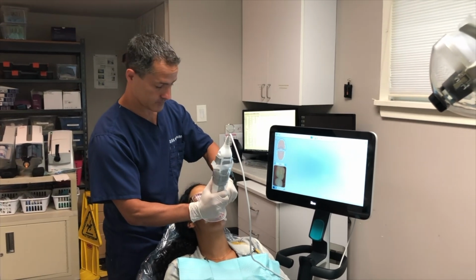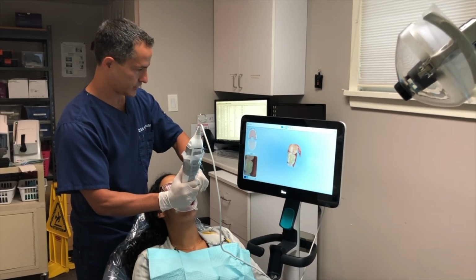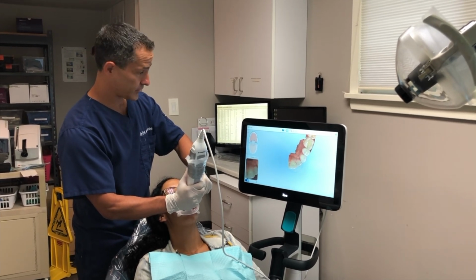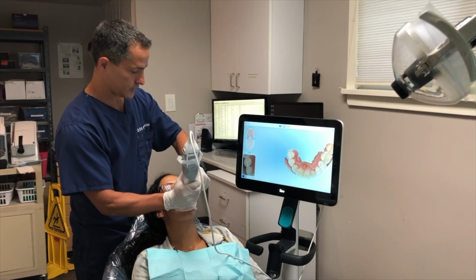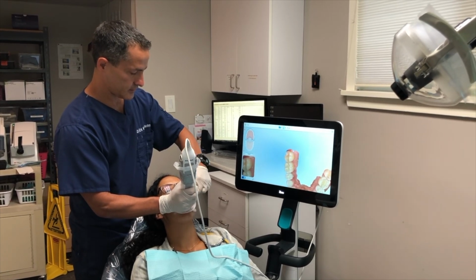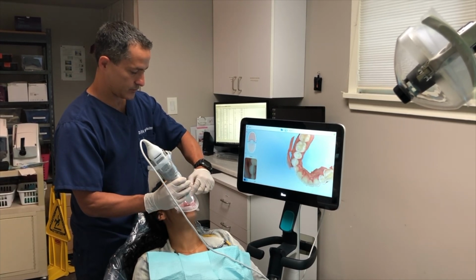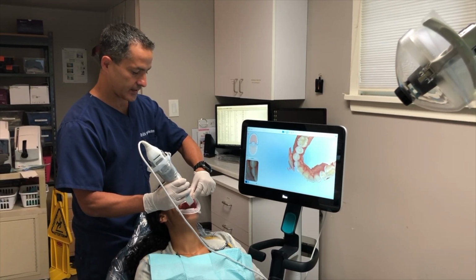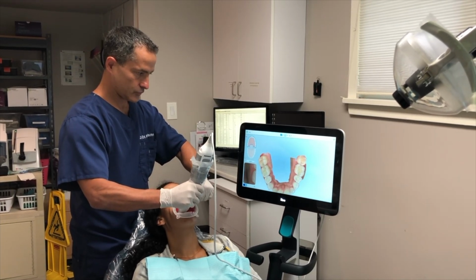One of the biggest things I see a lot of people doing is standing in the wrong position of the patient and then scanning one side and then jumping to the other. And the problem with that, it's kind of like taking an alginate and trying to reline it, because the computer has smart software, but it's trying to stitch things together. So a lot of labs will have problems with accuracy on the left versus the right, and you may not see it because the computer made it look nice, but it may not be accurate. So it might be one of the most accurate techniques that you can easily make inaccurate.